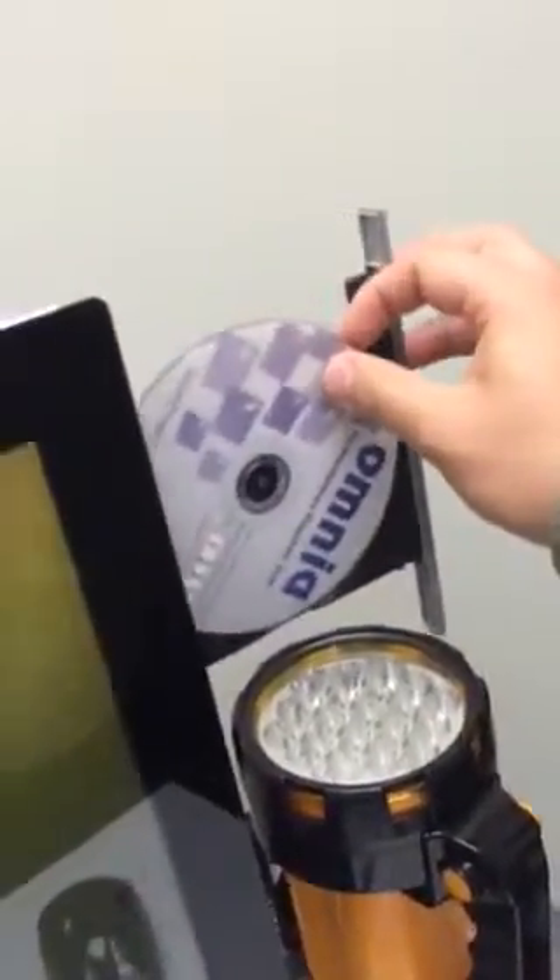We're here to test the PonyFX and how it works with the software that it works with. The software is called Omnia, and how we're installing it is that we're literally putting the Omnia CD into our CD reader. We're going to put it in the computer and then we're going to install it.